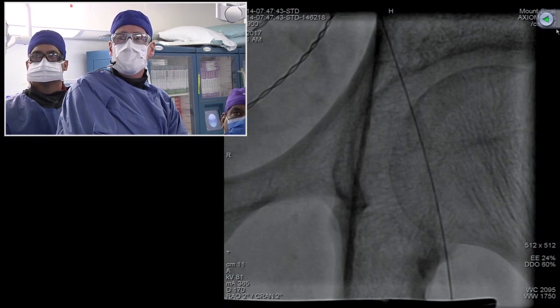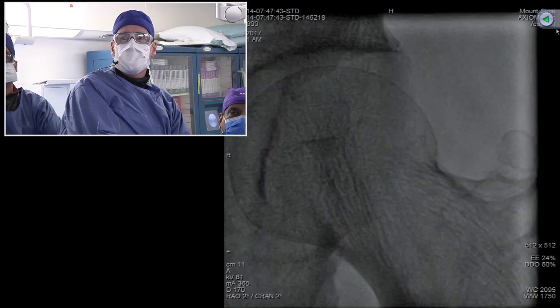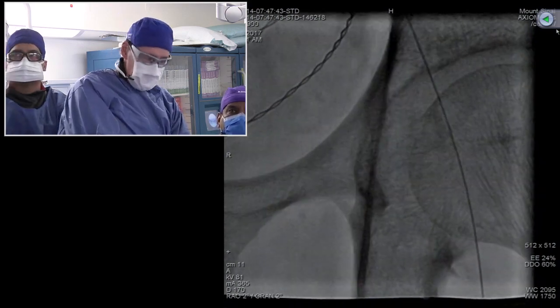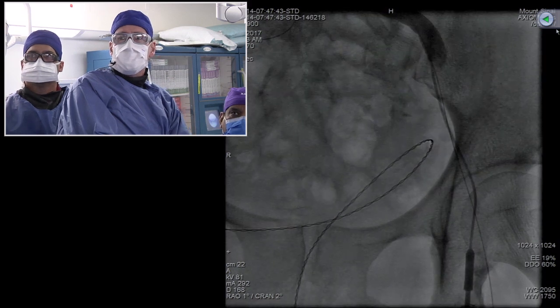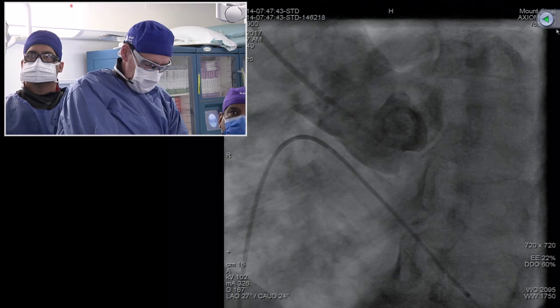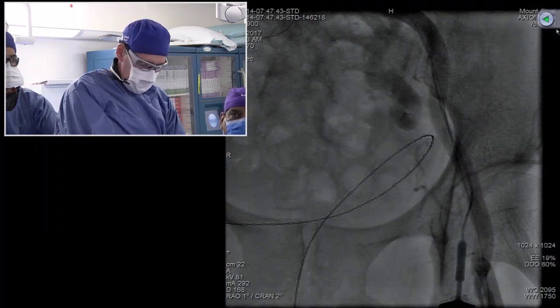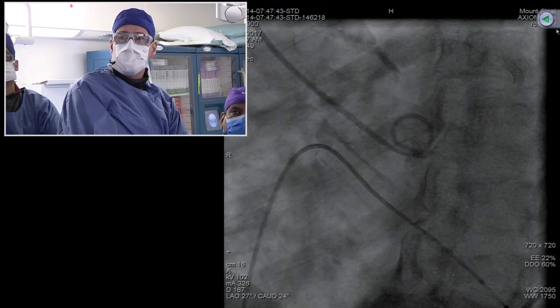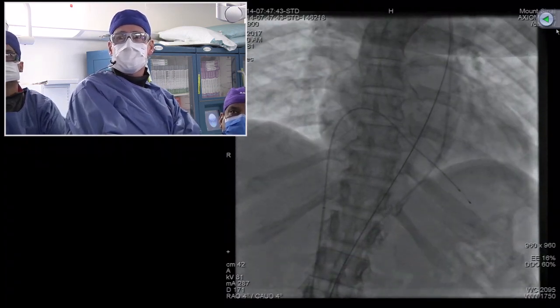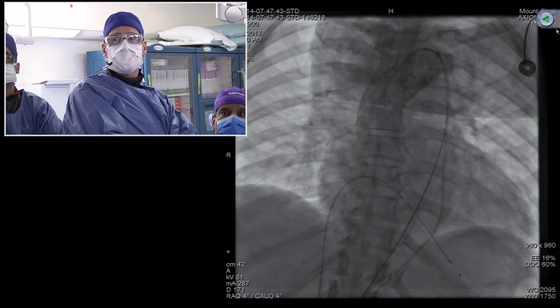We then went up and over, and you can see here on the left side we have a wire down. We're looking at the calcium in the access vessel. You can see spotty calcium there. We pre-dilated, and it was actually challenging then to get the sheath up. We had to pre-dilate the vessel and lubricate the sheath with Rotaglide to get the sheath up. And you can see here, this is an annular shot. I just want to also show you that the aorta itself is somewhat tortuous. There are a few bends that we had to navigate, and it was challenging to get the sheath up.